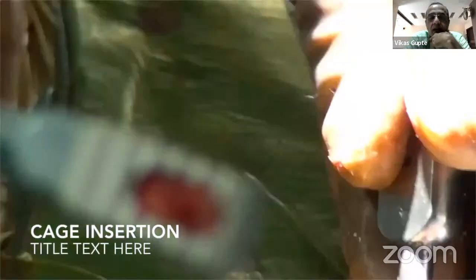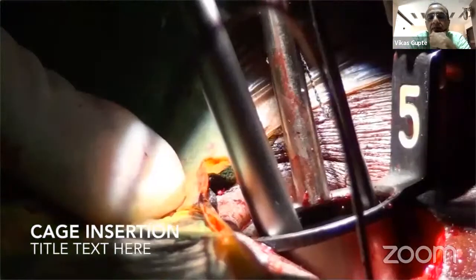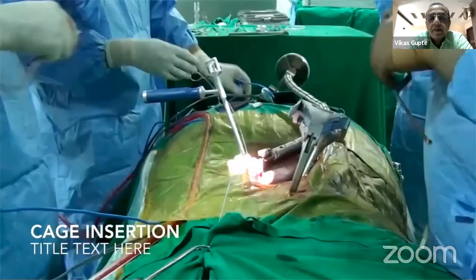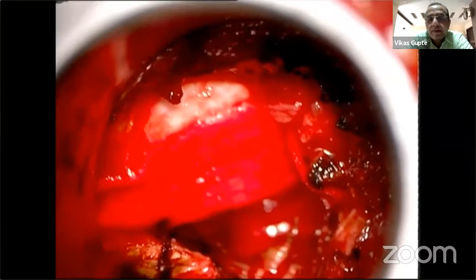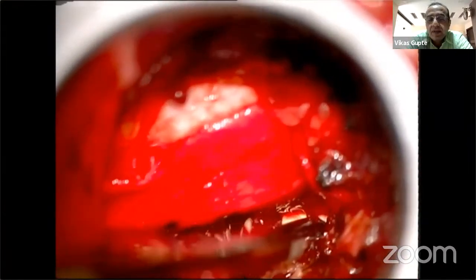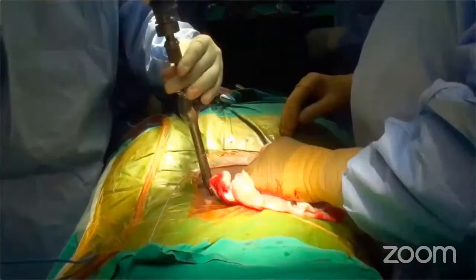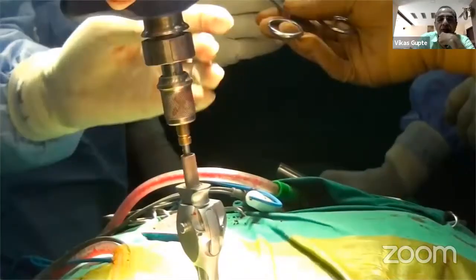Cage is filled with the bone graft and put into the disc space. Hemostasis is achieved. That's the cage. So 30 seconds more. Yeah, done. Fix the pedicle screws.